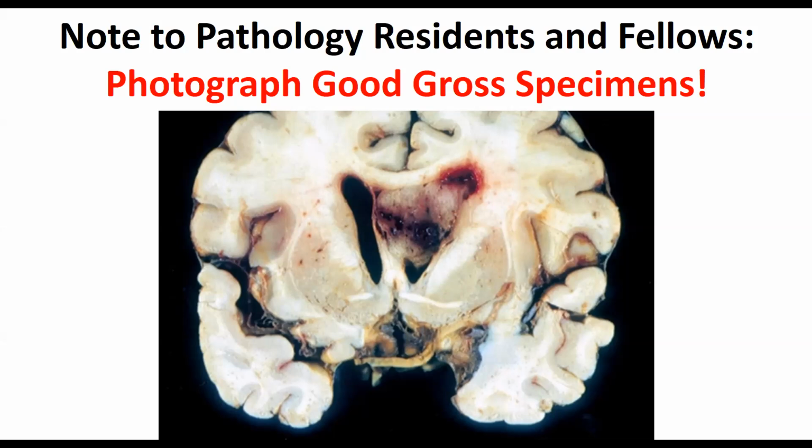I publish them all because most pathology residents do not take the time to get the photograph, even at a place like MD Anderson Cancer Center, where we have an entire department, an entire unit of medical photography that generates magnificent photographs like the one that you are seeing here. Magnificent. Take the time. What if it's frozen section? You say, well, I can't get a gross photo because the patient's on the table.